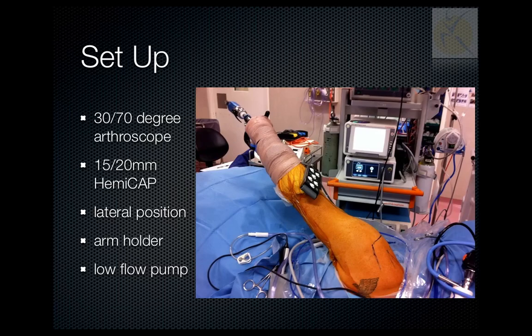Setup is obviously critical. Although we have not used the 70-degree arthroscope, we feel that this would be a good adjunct to this technique. We tend to prefer to use the lateral position, as the high anterior portal based on the glenoid is useful for looking down the line of the Hill-Sachs lesion. An arm holder with the ability to rotate the humerus is also essential, as is a low flow pump.